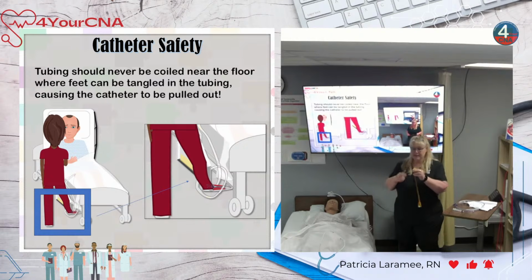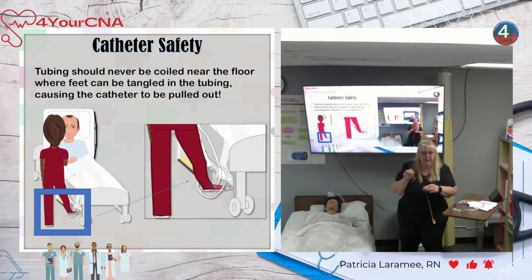Well, this balloon is going through a space this big. You're going to get tissue tearing. There will be a little bit of blood. There will be urine, and there could even be a little mucus. Okay? Your patient is not going to be happy. Not at all. This stings. Now, imagine peeing through that.